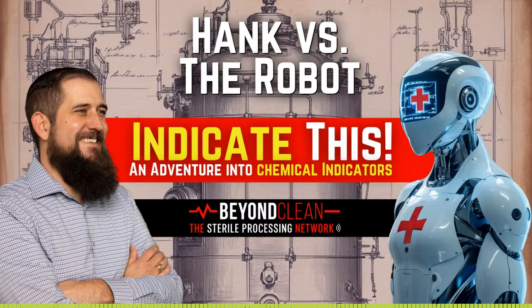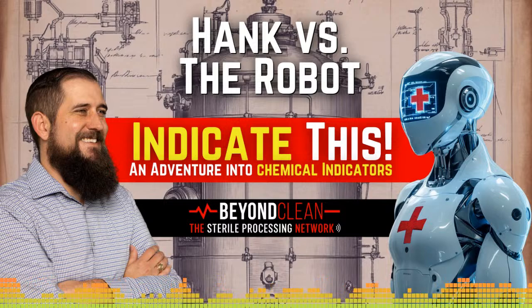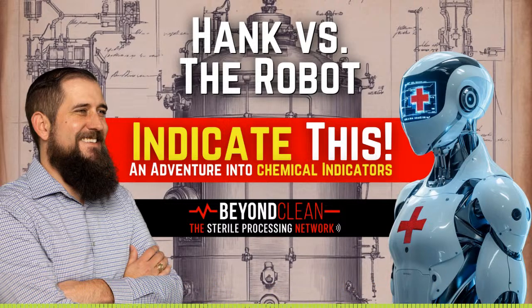Delayed results makes them less practical for every load. Higher cost and more complex to use than chemical indicators.